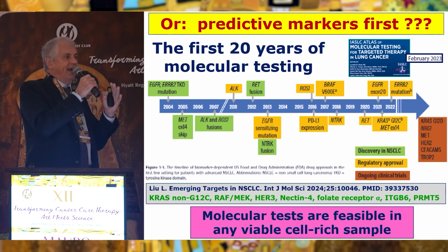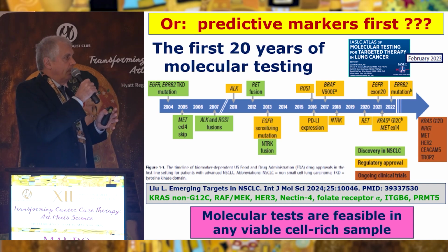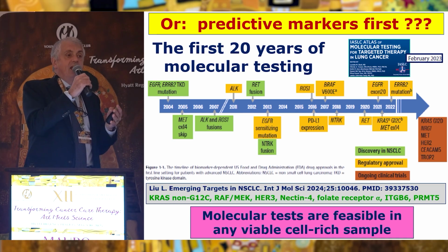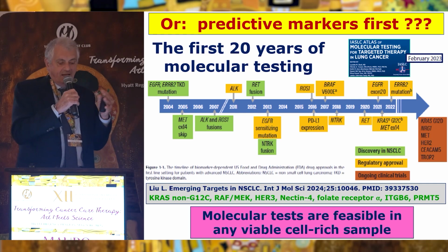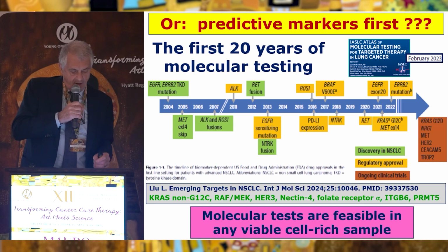If you want to go directly with PCR tests for single or few gene testing, you can do that as well. Sometimes there is the opportunity of making predictive immunohistochemistry, which means ALK, ROS1, for example, can be tested preliminarily by immunohistochemistry, but any lab can set their own ideal option for the work.